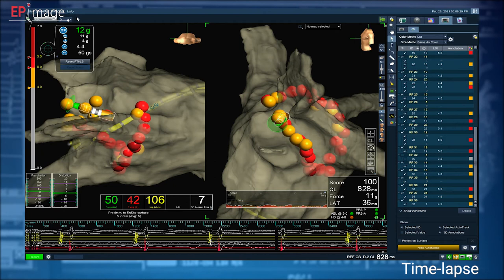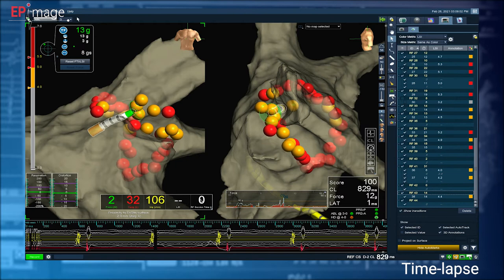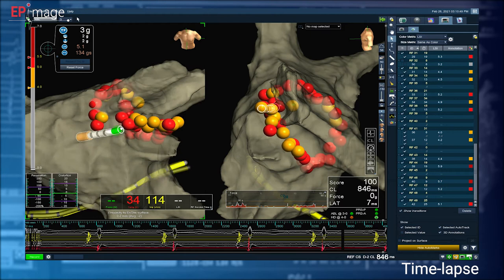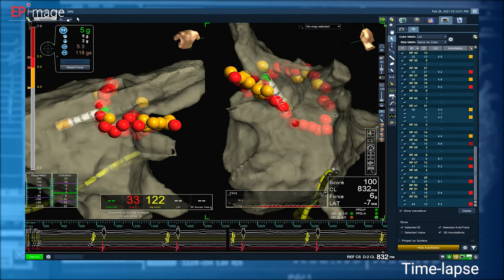So at the moment we are just closing the left pulmonary vein isolation. As you see, the catheter is quite movable in this position, and additionally deep breathing of the patient didn't help much. But finally we managed to close the line.